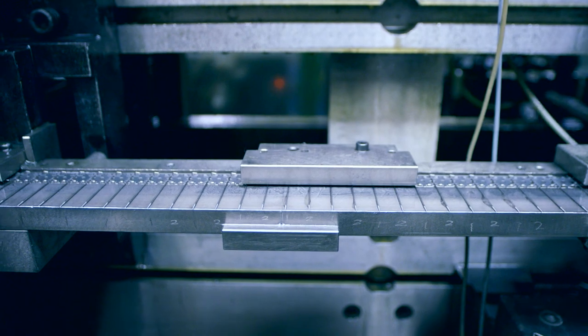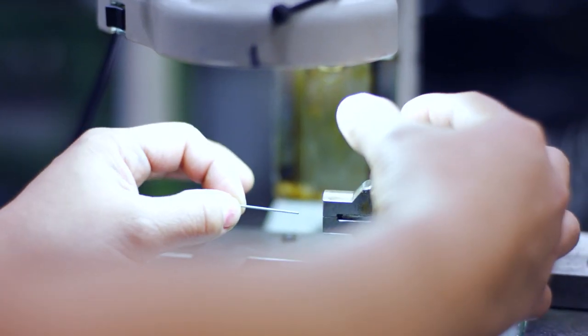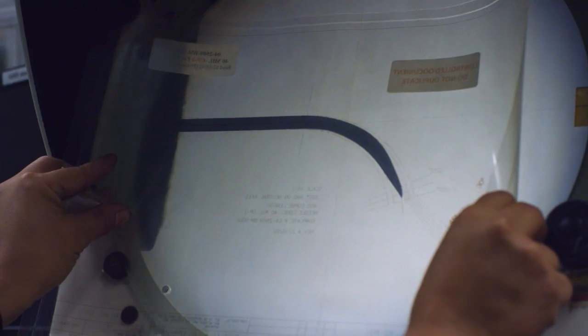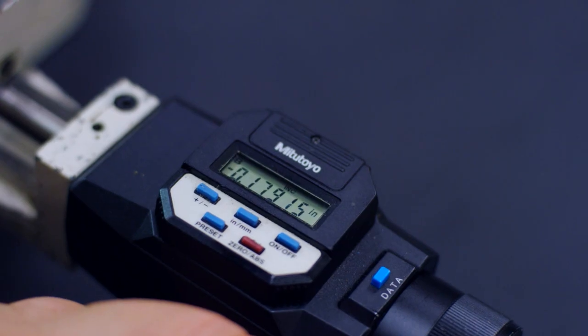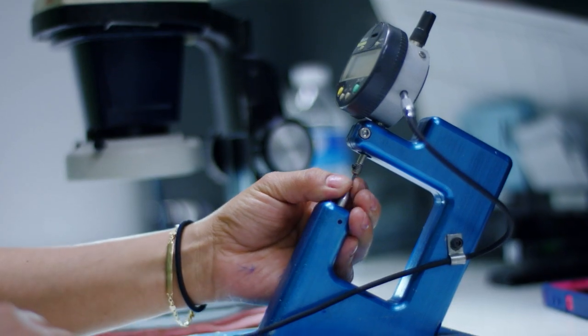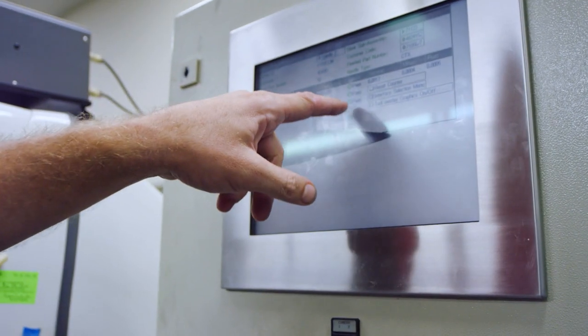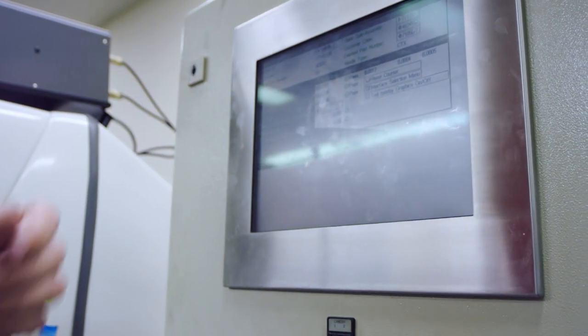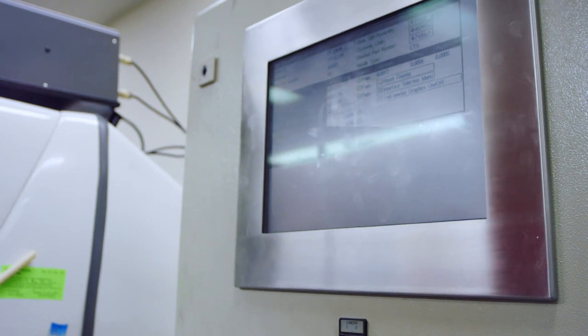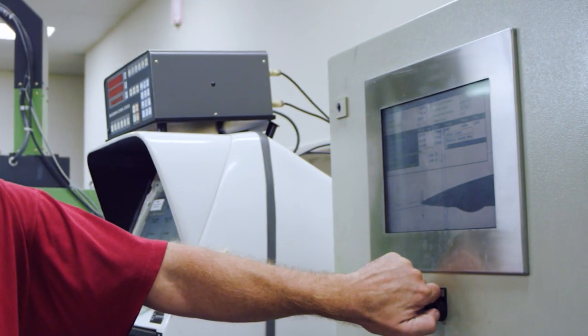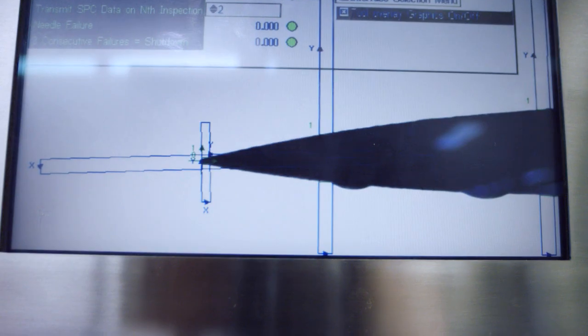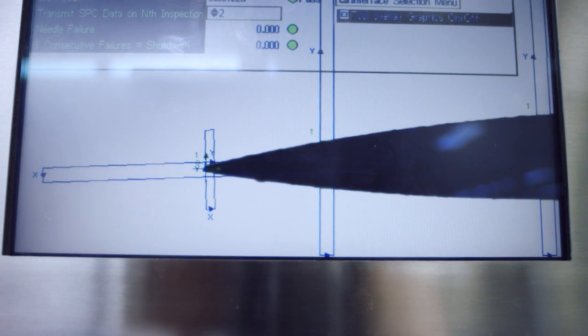Ethicon needles undergo numerous quality control checks throughout multiple manufacturing processes. Advanced high-speed vision systems constantly monitor tip profiles for accuracy. If there's something that happens to the needle during the process, the vision system picks it up.